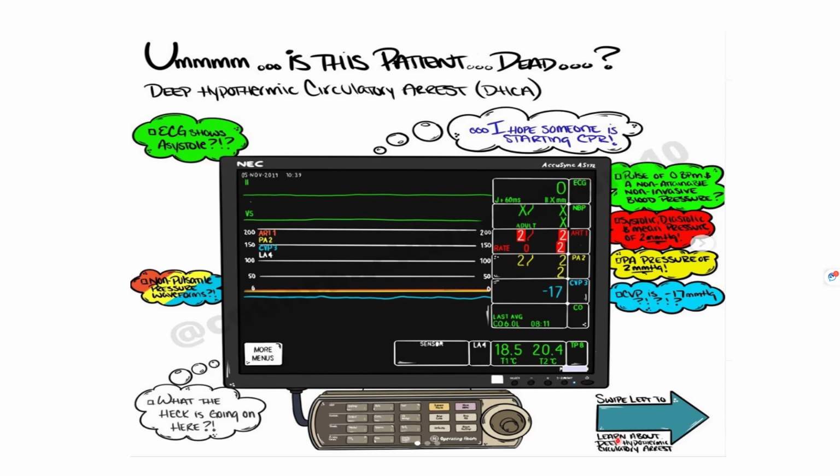So we might think, why can't they just stop the circulation and quickly do the anastomosis? But if they don't do a hypothermic circulatory arrest, your brain can only survive for 3 to 4 minutes without oxygen and without any supply. And this is where deep hypothermic circulatory arrest comes into the picture, because once you arrest the heart in hypothermia, you are reducing the metabolic demands, you're protecting the organs, and then it's safer to do it.